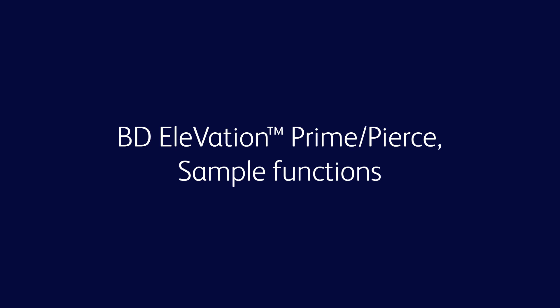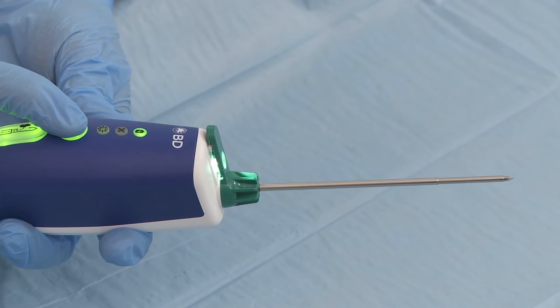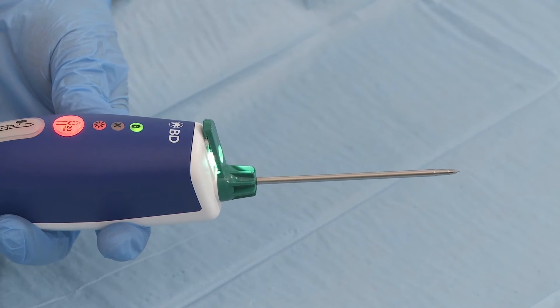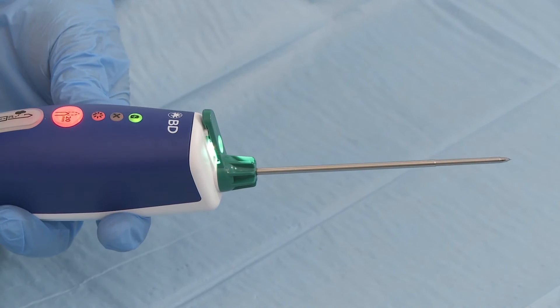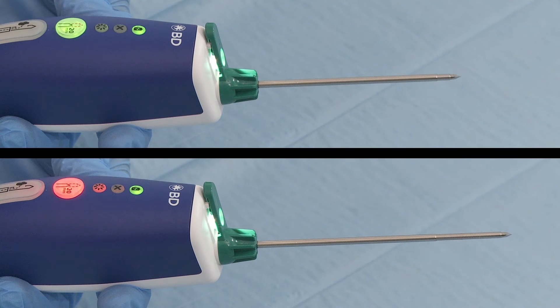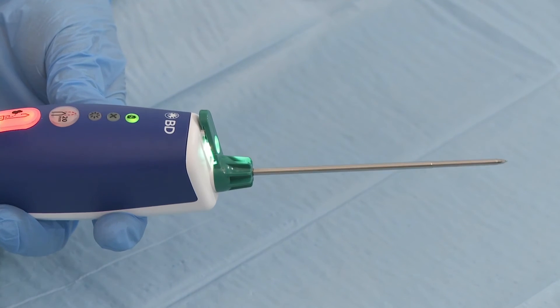The prime pierce optional function is intended for the user to advance the needle 2 cm (20 mm) into the breast and/or lesion. On pressing the prime pierce function button, a motor pulls back against two parallel springs. On pressing the button again, the motor releases the springs to pierce. The needle is advanced 2 cm (20 mm). Sampling is done by touching the sample button.